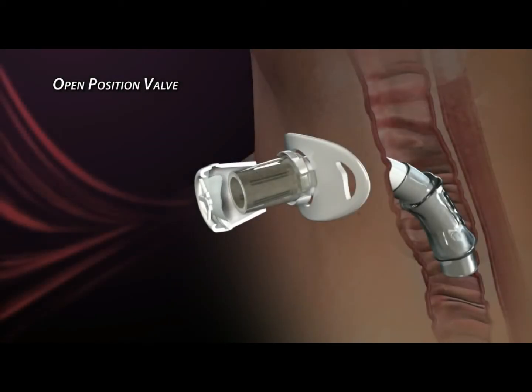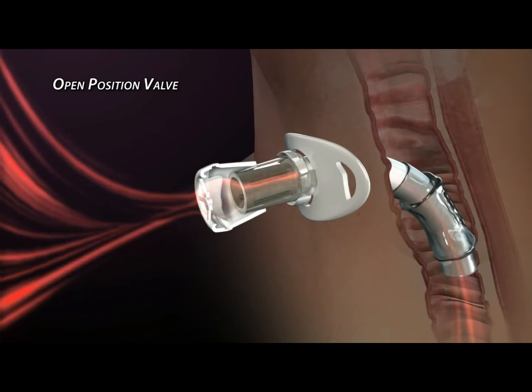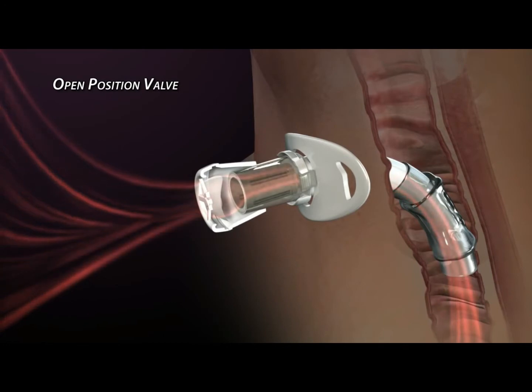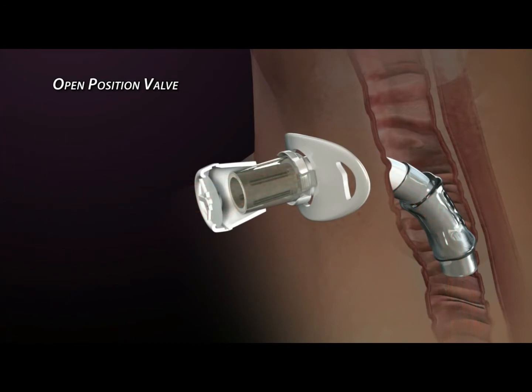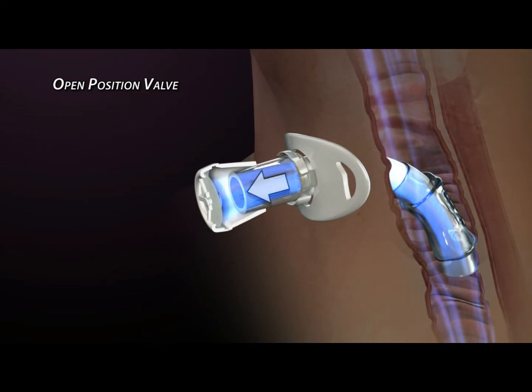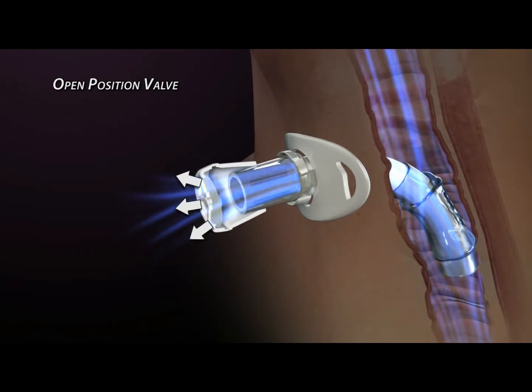The membrane flexes during inhalation, which allows air to pass around it and through the tracheostomy tube. When the inhalation cycle reaches its peak, the membrane temporarily relaxes and returns to its normal position. At this point, the valve is not actually closed. Reversed airflow, which is produced by exhaling, is necessary to force the membrane against the valve body to produce a seal. Before the membrane actually closes, there is a short time lapse where some exhaled air can escape.